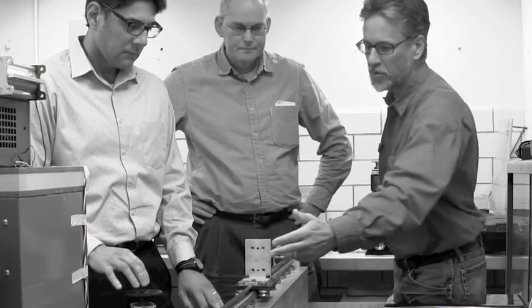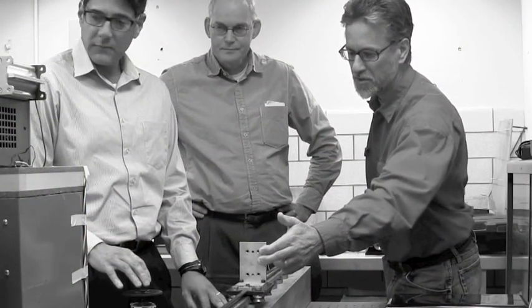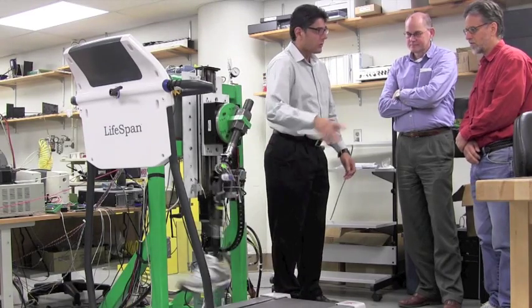With current above knee prostheses, amputees typically walk with an unnatural, stiff-legged gait. This often leads to other health problems. Our prosthesis will emulate the gait of an able-bodied person and reduce adverse health effects.